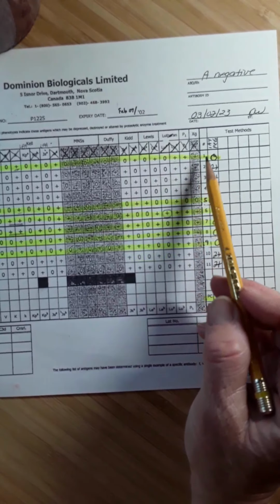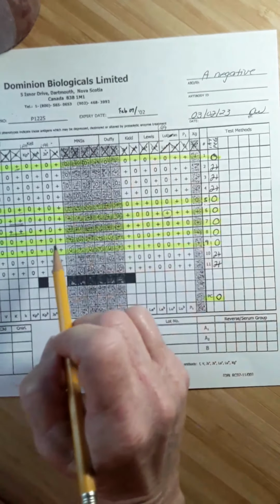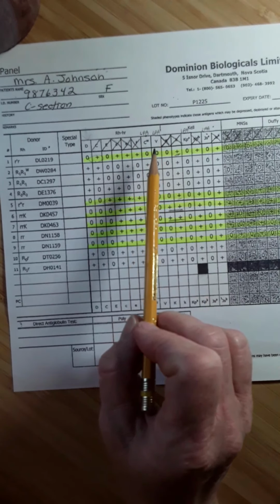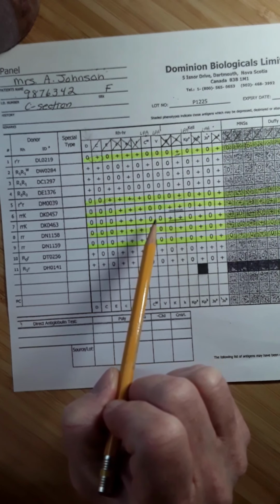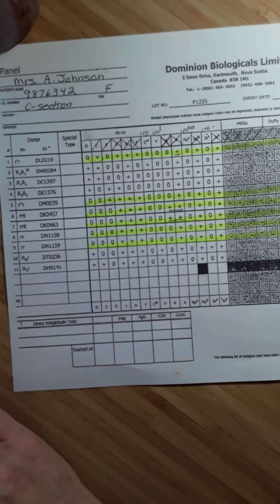The rest of the page here, actually Lutheran A is an LPA. And that's it. Now the reason I've done that is because antibodies to low prevalence antigens will be very difficult to cross out because we don't find the antigens represented on the panel cells. So we do not go to extra work to try to find a panel cell that has these low prevalence antigens on it because it's very difficult to find. So this information is at the bottom of page 9.